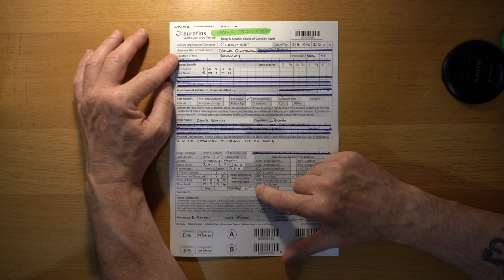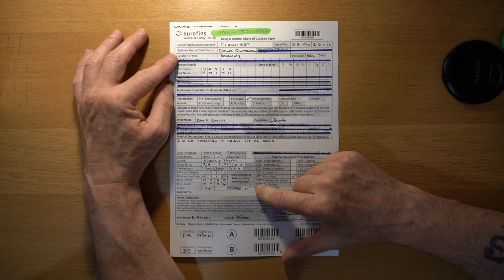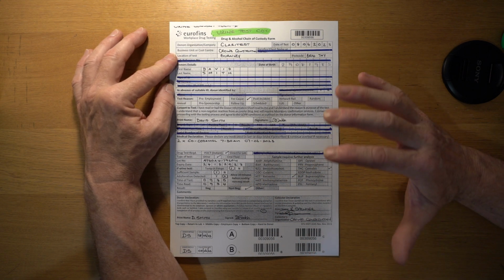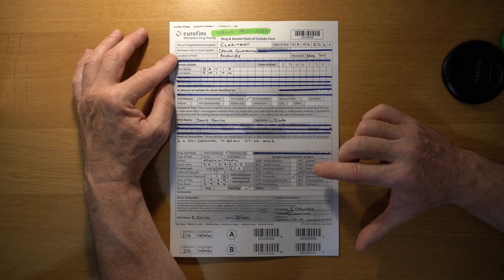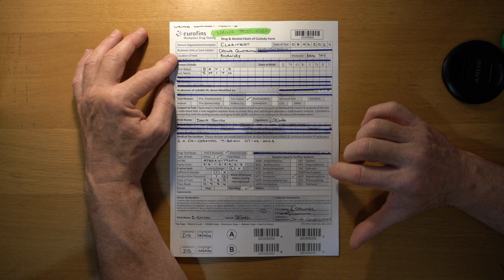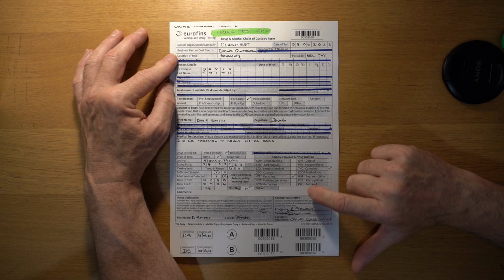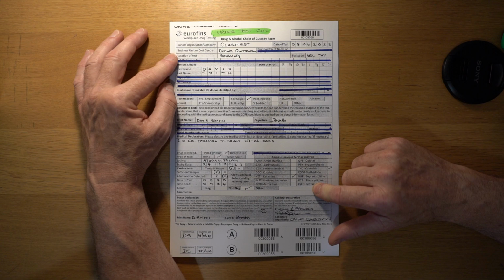You're probably only going to be doing this test and send samples off to the laboratory as non-negative, so you'll need to tick the non-negative box. And over on the right hand side, you'll need to say what the person has failed the initial test for. In this case, it was ketamine and cannabis. But if it's one of the drugs that hasn't been listed on here, you'll need to write other there for any other drugs you want the laboratory to test for.